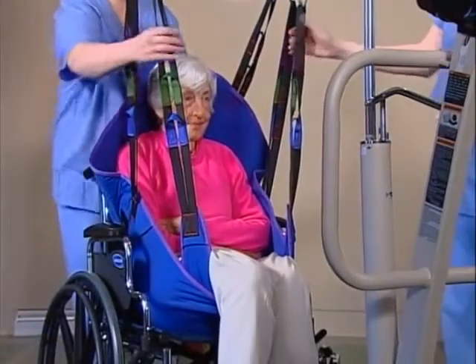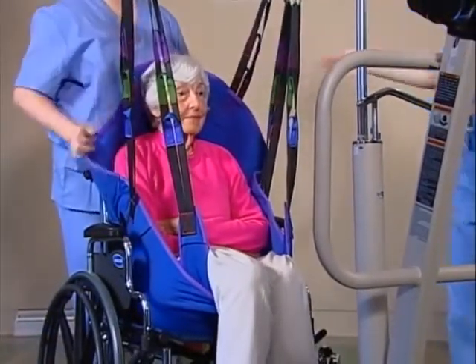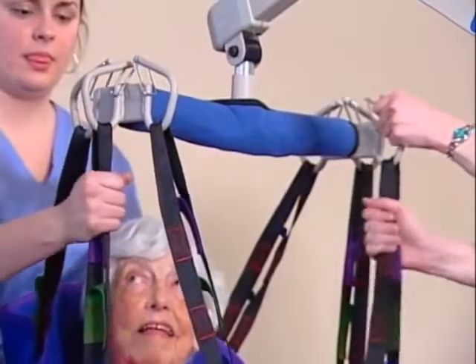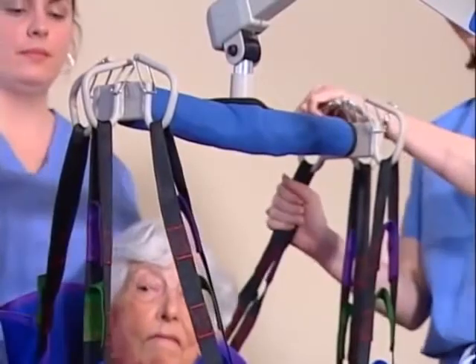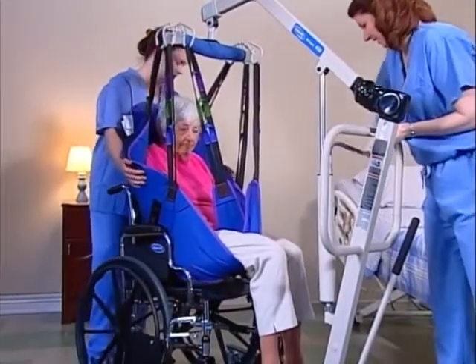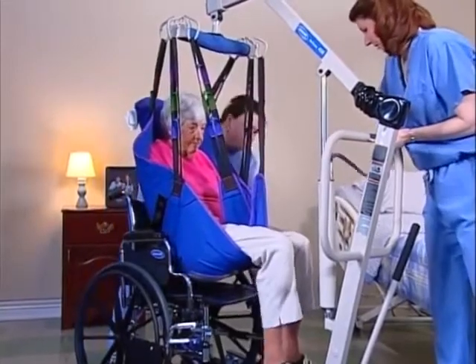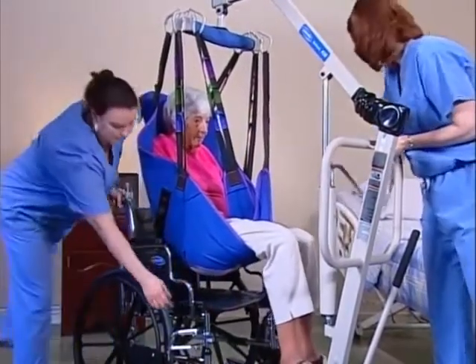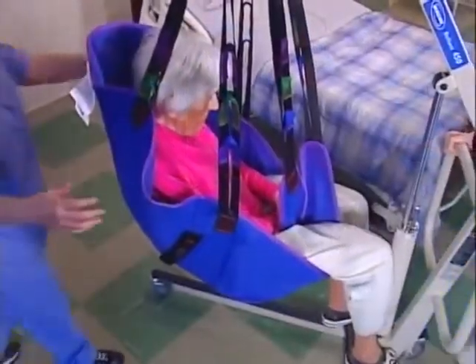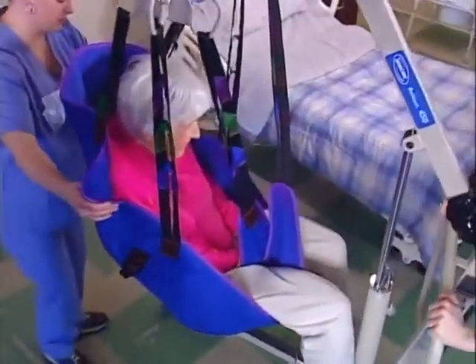Double check to make sure that all of the attachment points of the sling are properly attached to the swivel bar. If they are not, lower the sling and fix them. Pump the unit several more times until the resident is just above the wheelchair. The other caregiver can use the sling handles to maneuver the resident.